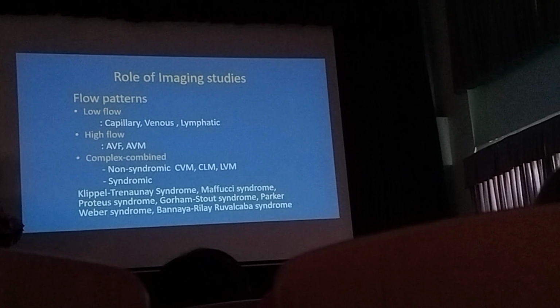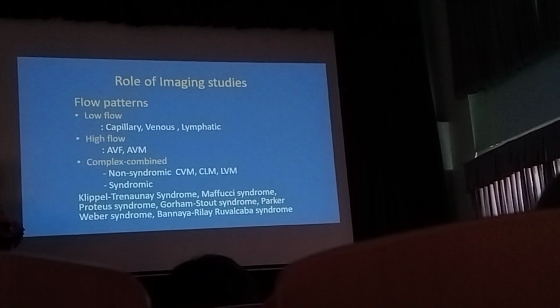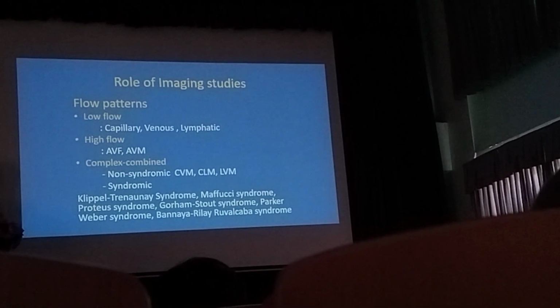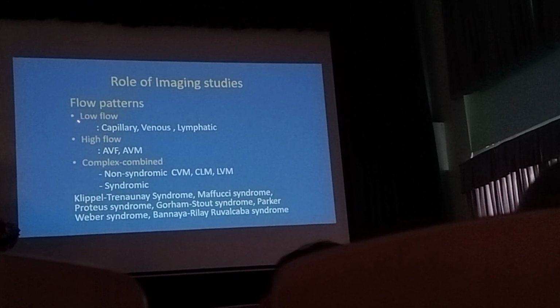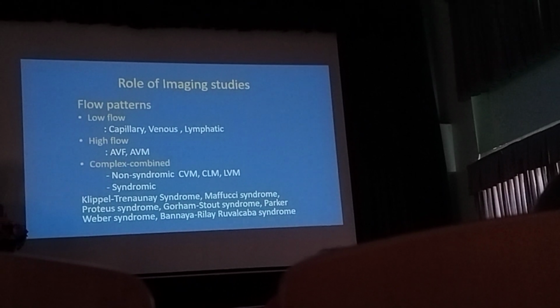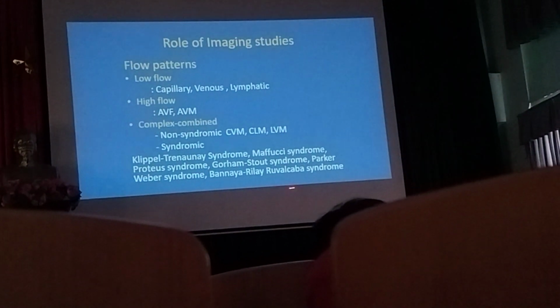Okay. The imaging pattern have the characteristic for vascular malformation. And for vascular malformation, we will classify it as low flow, high flow, and complex. Complex is considered associated with multiple syndrome.